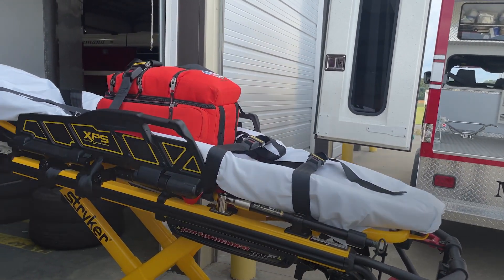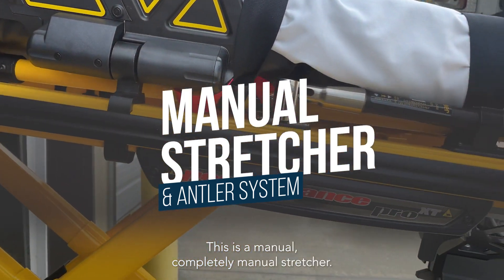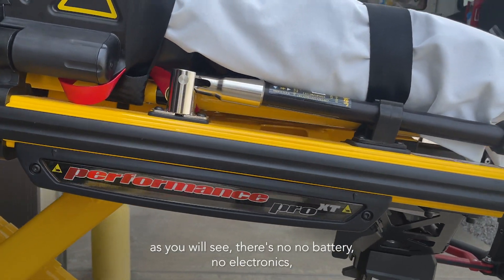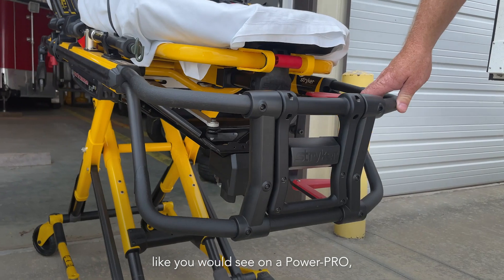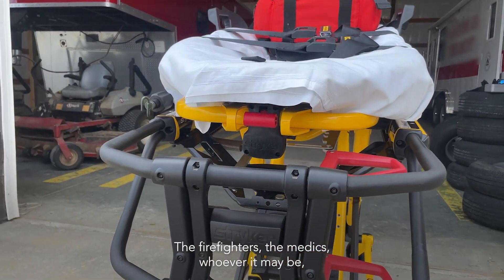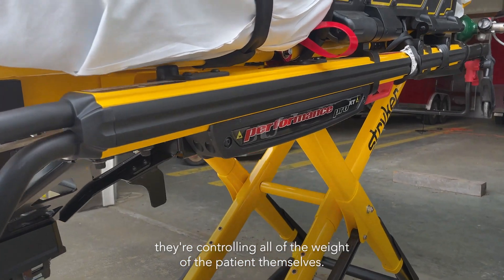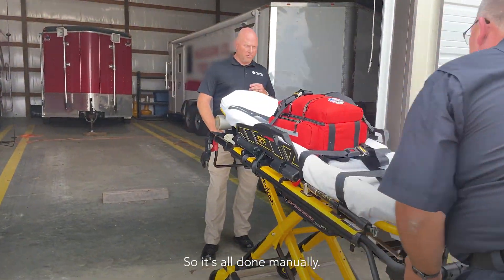This is a Stryker Performance Pro — not a power pro, but a performance pro. This is a completely manual stretcher. As you will see, there's no battery and no electronics like you would see on a power pro. With a manual stretcher, the firefighters, the medics, whoever it may be, are controlling all of the weight of the patient themselves. There's no power assist, so it's all done manually.